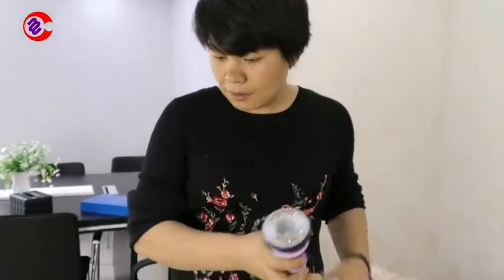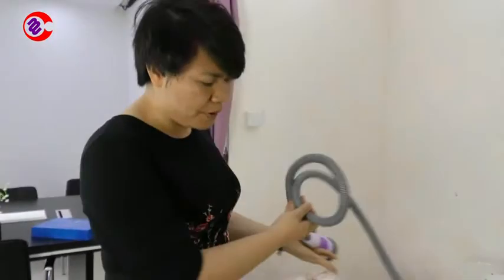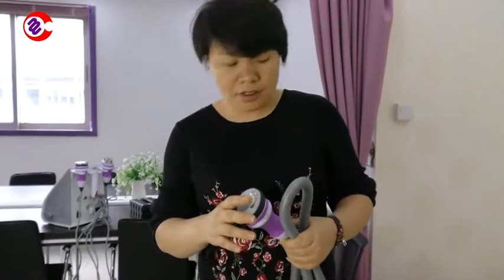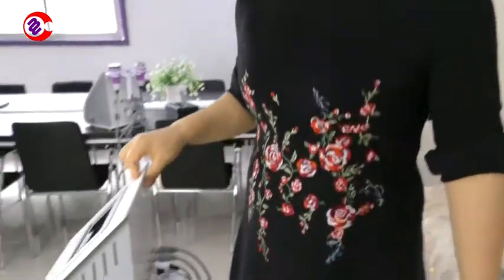We will test the vacuum suction on this handle. Sometimes people will see that there is no suction for this vacuum handle, and I will tell you how to set the vacuum suction.